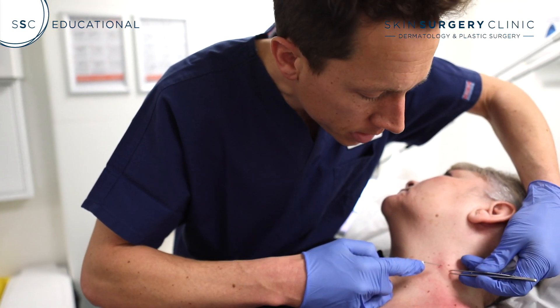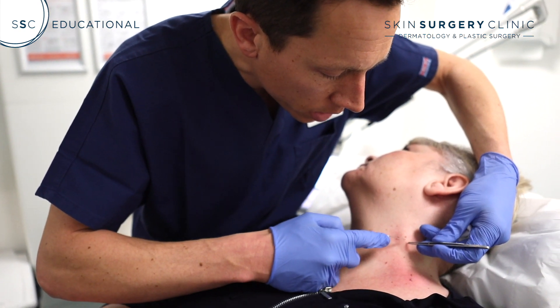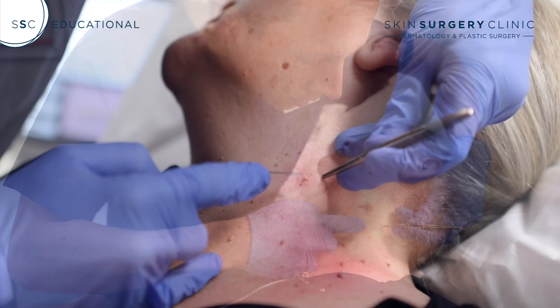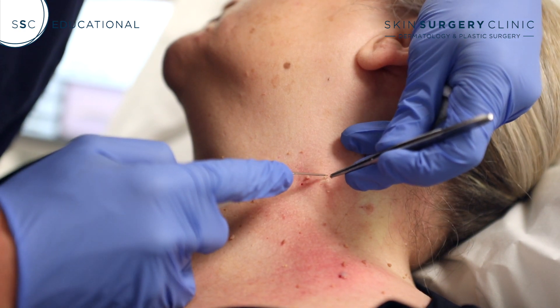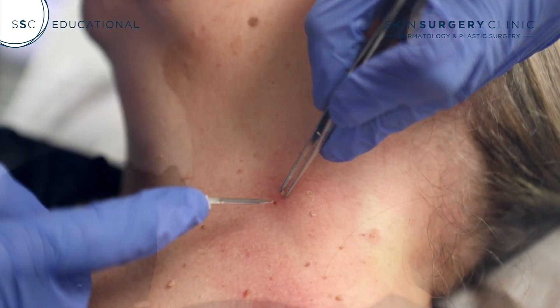It's a really quick and safe procedure. All it involves doing is just lifting them off the surface of the skin. Third or final one.